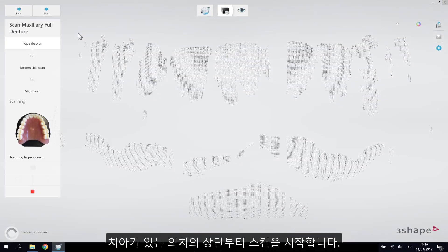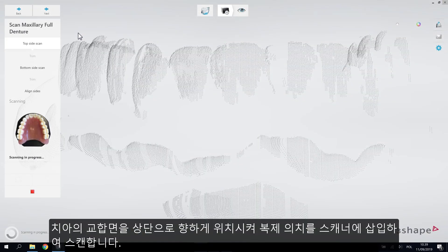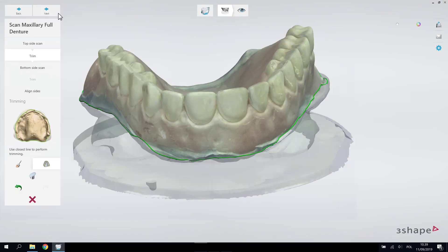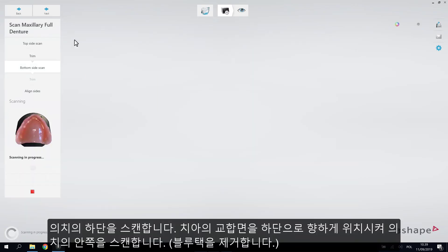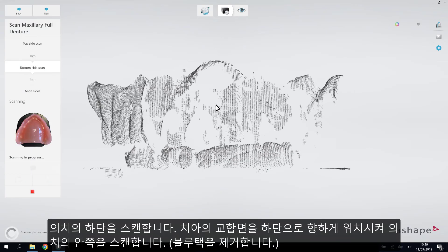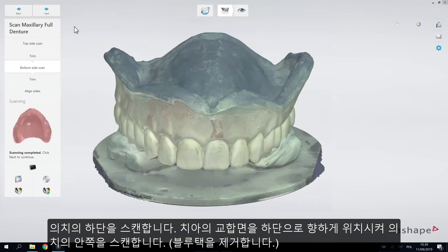Start scanning the top side: insert the copy denture with the teeth facing upwards into the scanner and perform scanning. When the scanning is completed, trim away the blue tack from the scan. Then scan the bottom side: insert the upper side of the denture with the teeth facing downwards into the scanner and run the scan.